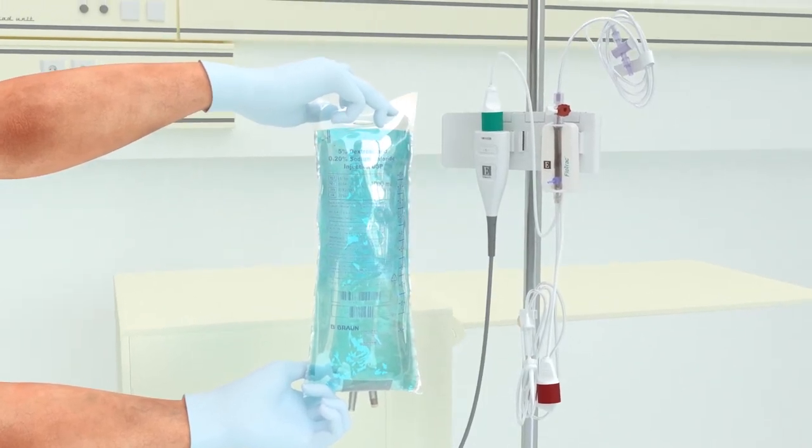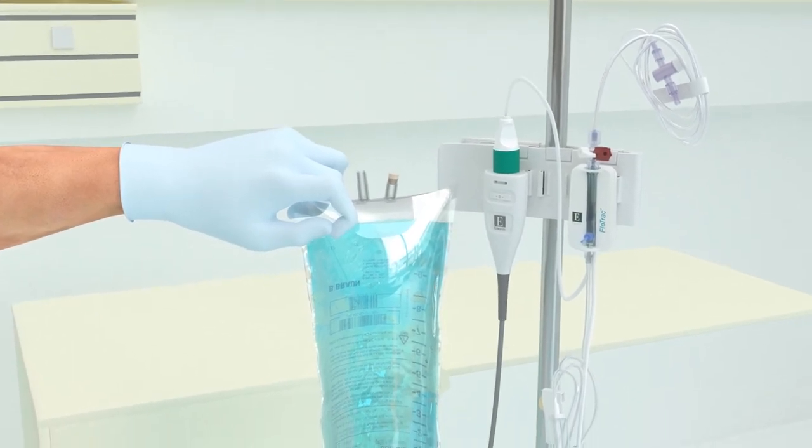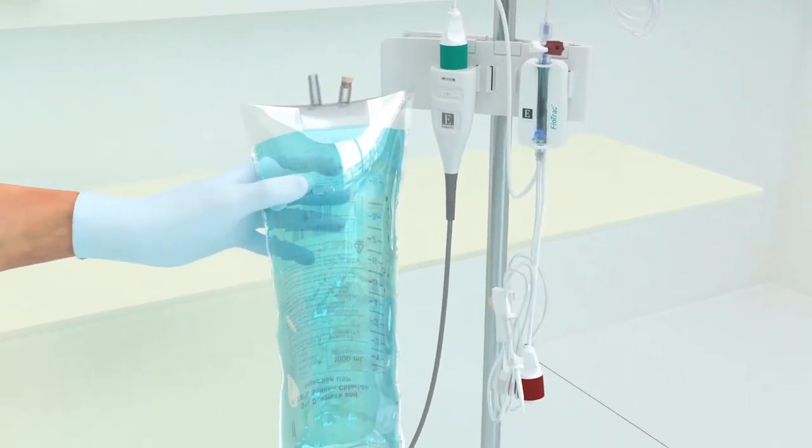To remove the air and prime the FlowTrack system, invert the fluid bag. Spike the fluid bag.